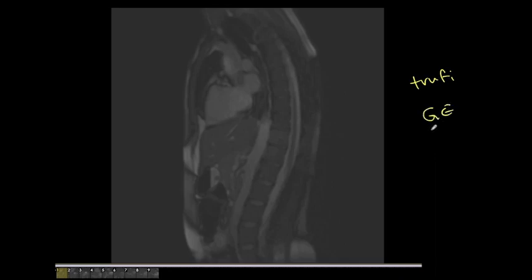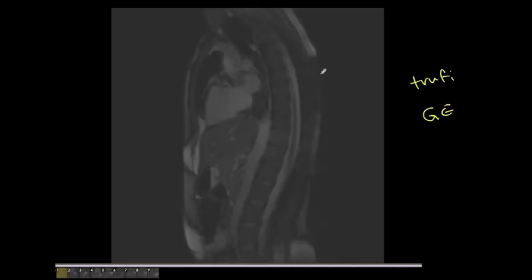The first acquisition, as you can see, is a number of 3 to 5 slices in each direction, in the sagittal, in the coronal, and in the transaxial. The importance of this is that on the scanner you will have marks that show you where is the isocenter of the scanner, so you can tell if the heart is in the isocenter or not. You will use this first acquisition to plan the rest of your scanning.